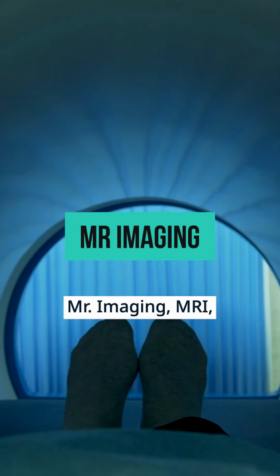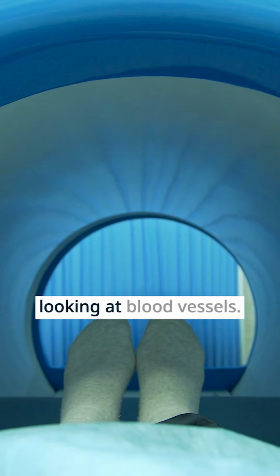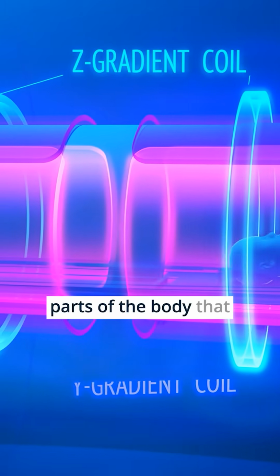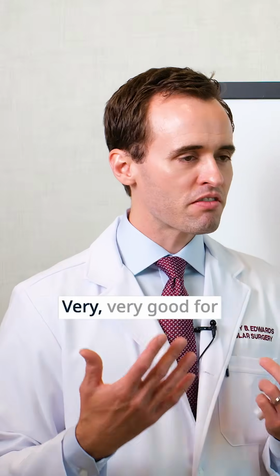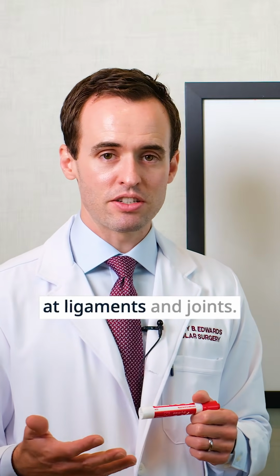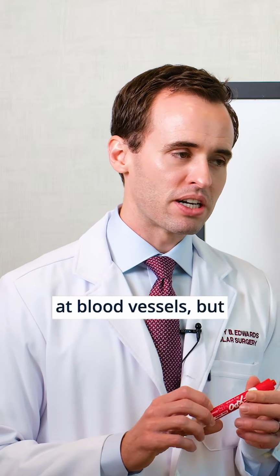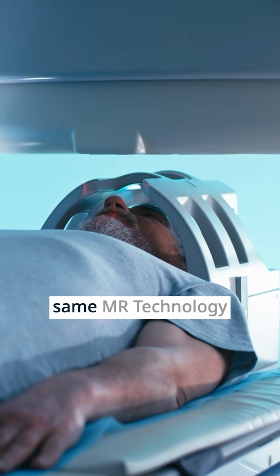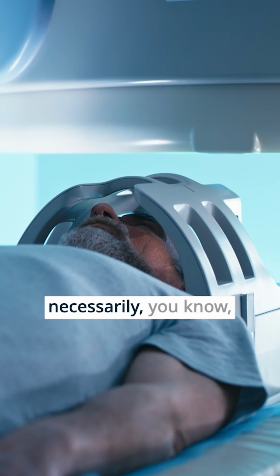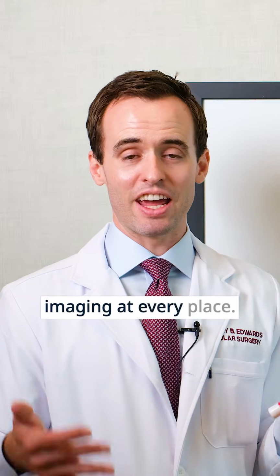MR imaging, MRI, sometimes MRA, which is an MR angiogram looking at blood vessels. This is a different type of imaging to view all different parts of the body that does not use radiation. Very, very good for looking at soft tissue. Very, very good for looking at ligaments and joints. It is good for looking at blood vessels, but we don't have the same MR technology available everywhere. So I wouldn't say that it's necessarily the standard vascular imaging at every place.